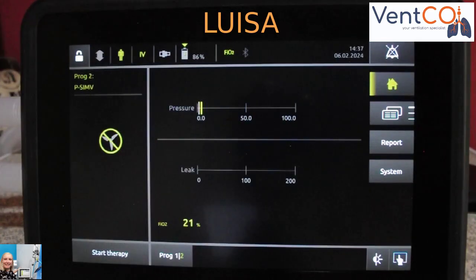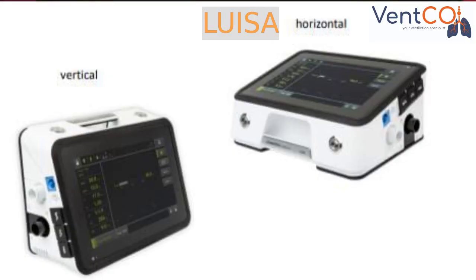The Luisa can be used in the vertical or horizontal position, and the screen rotates, just like you would have on a cell phone.